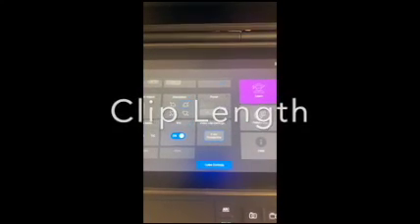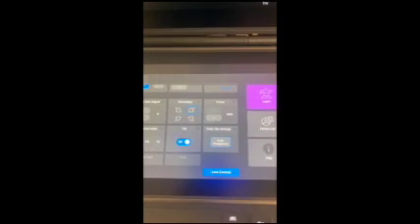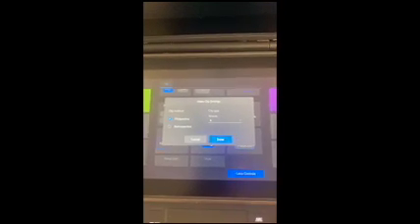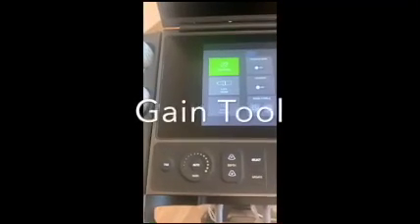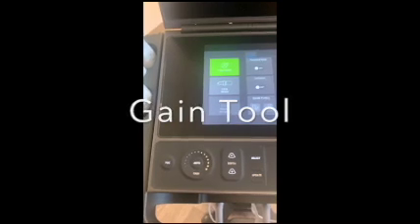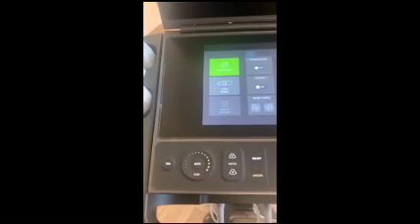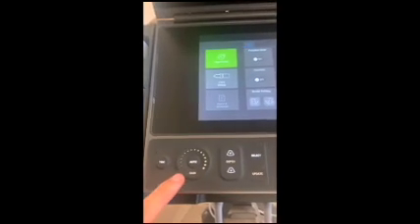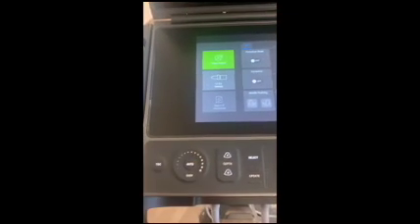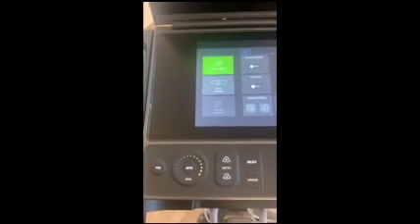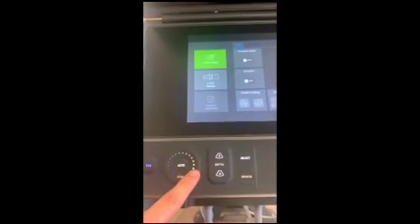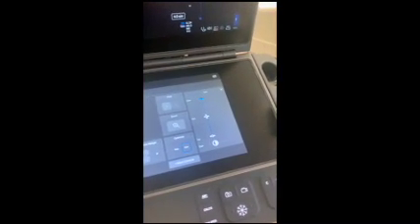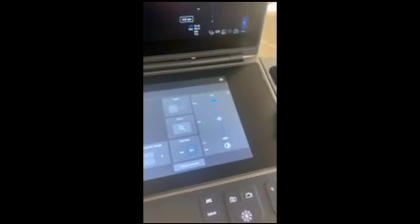If you want longer or shorter video clips when saving a video, you can click this button and change it exactly how you'd like. If you'd like to adjust the gain, which for simplicity is the brightness at various levels on the screen, you can have the machine do that automatically by clicking auto, or if you prefer to adjust it yourself, you can raise and lower the brightness here. When you do that, it slides the gain tool over on the right.